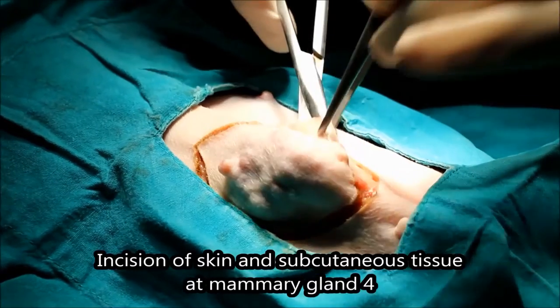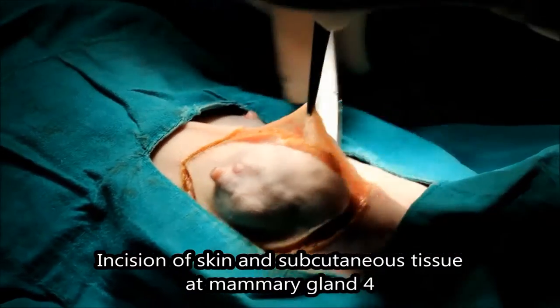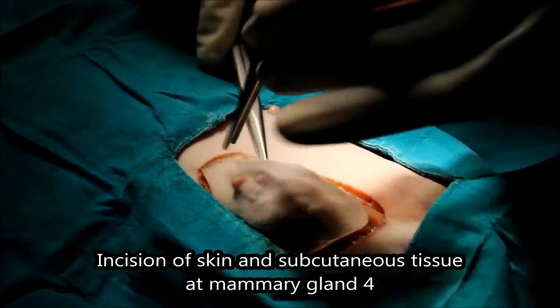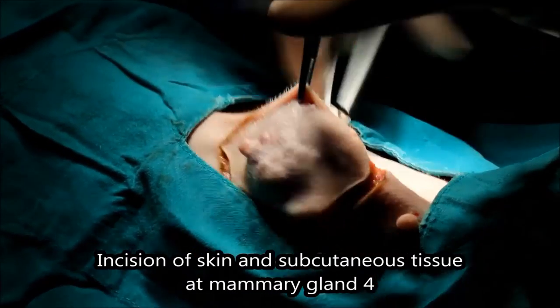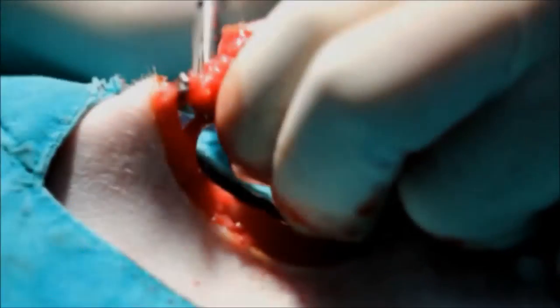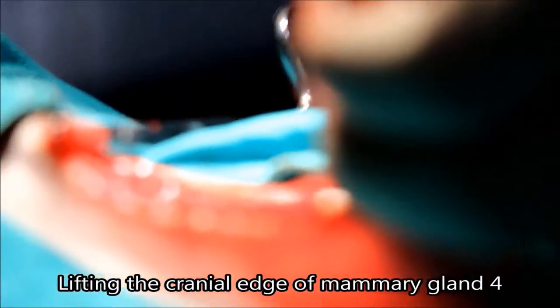The vet has incised the skin using electroincision and is now separating the subcutaneous tissue from the abdominal fascia. Then the vet lifts the cranial edge of mammary gland 4 on the right.